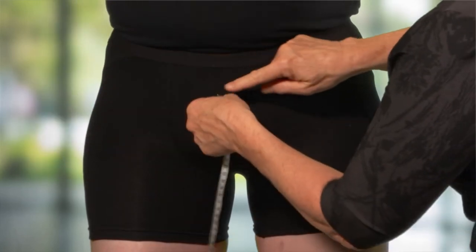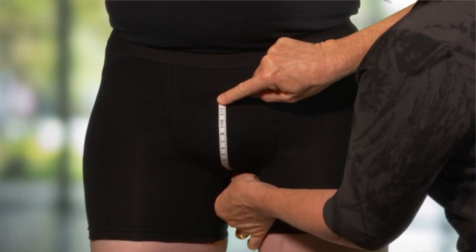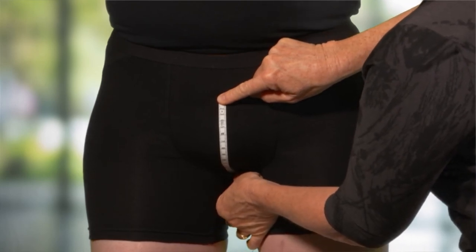A further contour measurement is then taken from the anterior of the base of the penis, over the scrotum and under to the perineum.